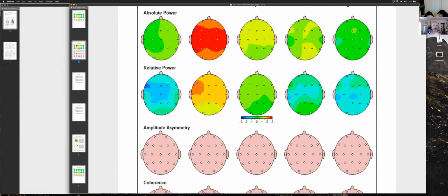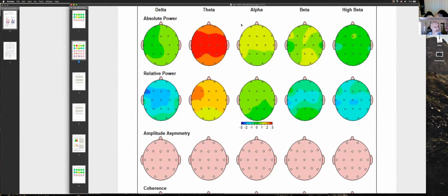And sometimes when the left front gets higher in the slow brain waves like this, people can have difficulty with mood or motivation. They're not resilient or buoyant enough. Is that true for you? Any issues with motivation or mood? Yeah? All right, I'm sorry to hear that. I'm glad we're seeing some of it because it's pretty straightforward to work on.